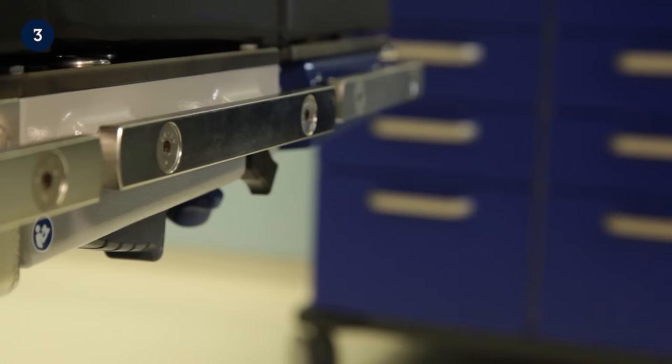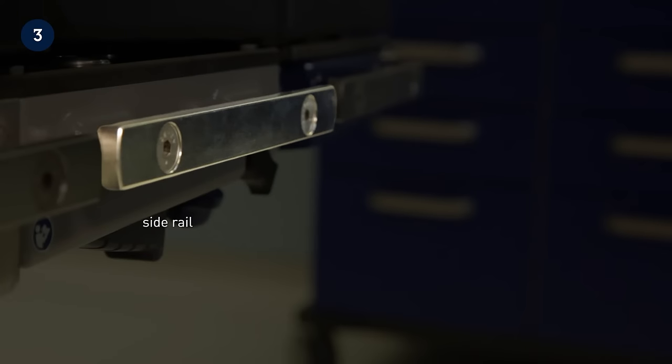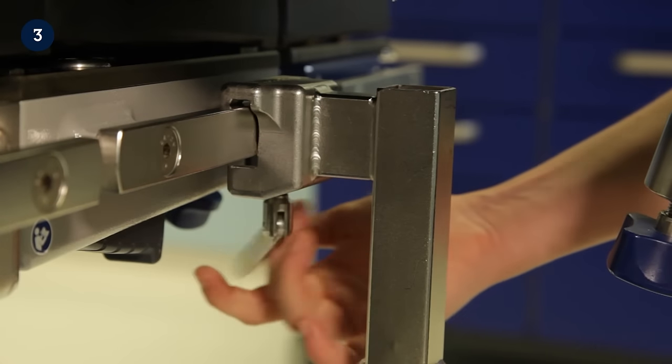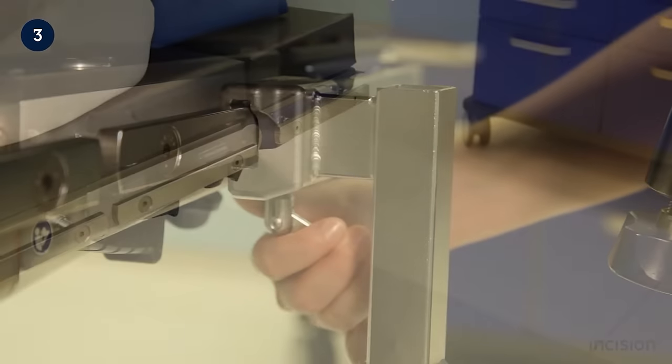A number of accessories can be mounted to the side of the table to aid with patient positioning. The accessories are mounted onto side rails found along the side of the table using standard or radial setting clamps, as now shown. The mounting of some examples of accessories will now be demonstrated.